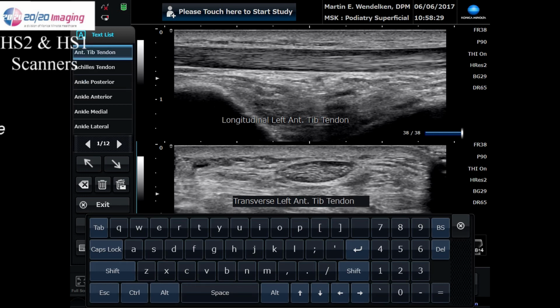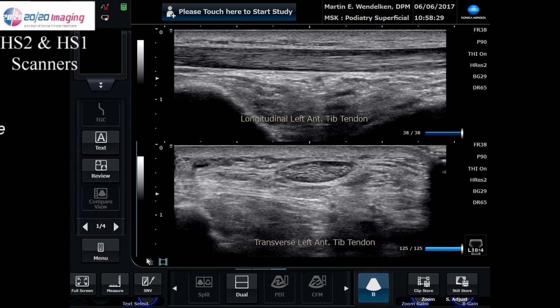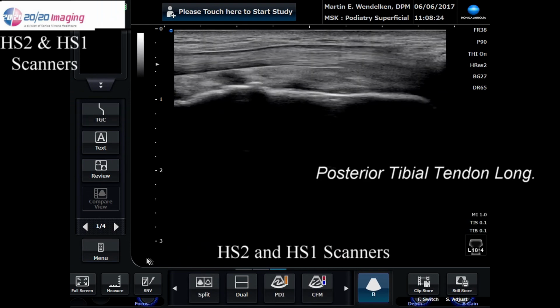of the same tendon. Also, you can notice that there is a keyboard, and you can type anything you'd like on the keyboard, which ends up directly on the screen. Once the annotation's on the screen, you do have the ability to move it anywhere you want and locate it at different spots on the screen.